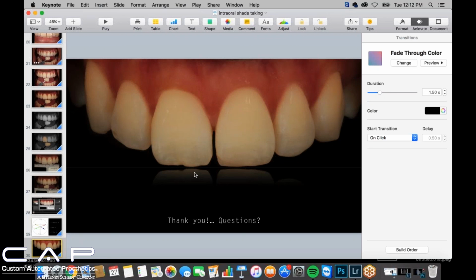Okay. Good question from Martin York. What about using diffusers that attach to the stock flash, like the ones PhotoMed offers? I meant to mention diffusers earlier, but I forgot, so thank you for the reminder. As far as the stock flash, I'm assuming that's the one that pops up in the front.